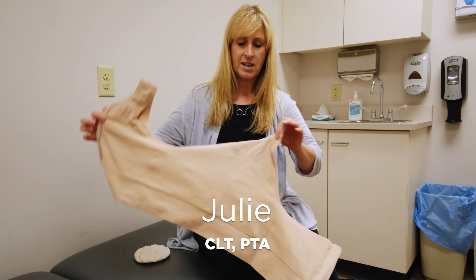If you have more aggressive swelling, you're going to end up with a product like this. What this does is it allows you to have compression on your breast, compression all the way around the side of the trunk, and then onto the backside. The reason that that is there is because this is designed to move fluid from this breast around the backside and into the armpit on the other side. In order to place this in here, I start with this tail, use the opening here, put this tail in, then I can reach around and use the other side, bring my hand in here, reach through, and kind of fishtail this in.